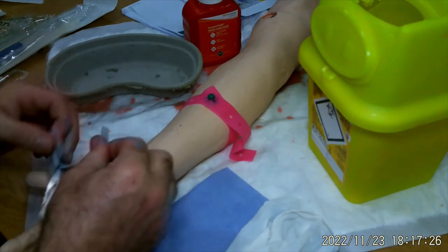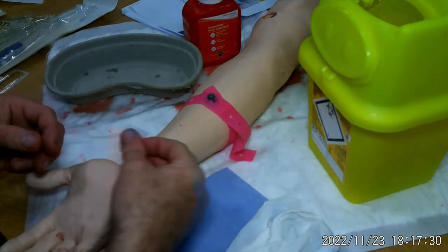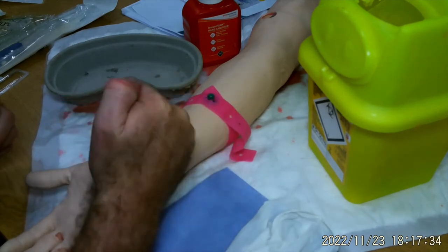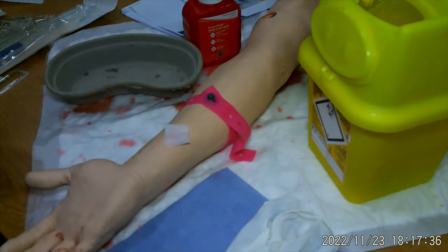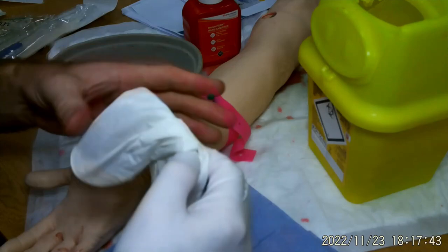Now I'm going to take my alcohol swab out — single wipe, domestic waste. What some people do is leave this as an arrow pointing towards where they're going to cannulate. Allow that to dry, making sure it doesn't actually touch it. At this stage, I'm going to put my gloves on.